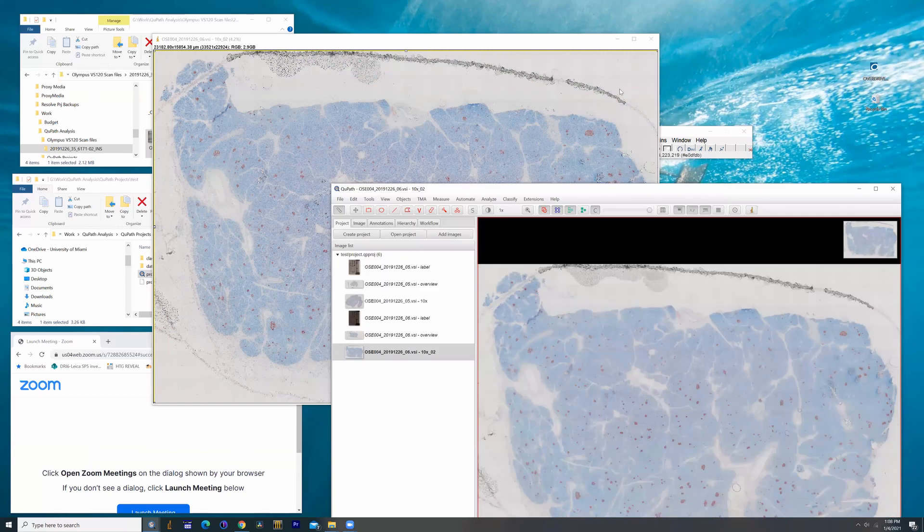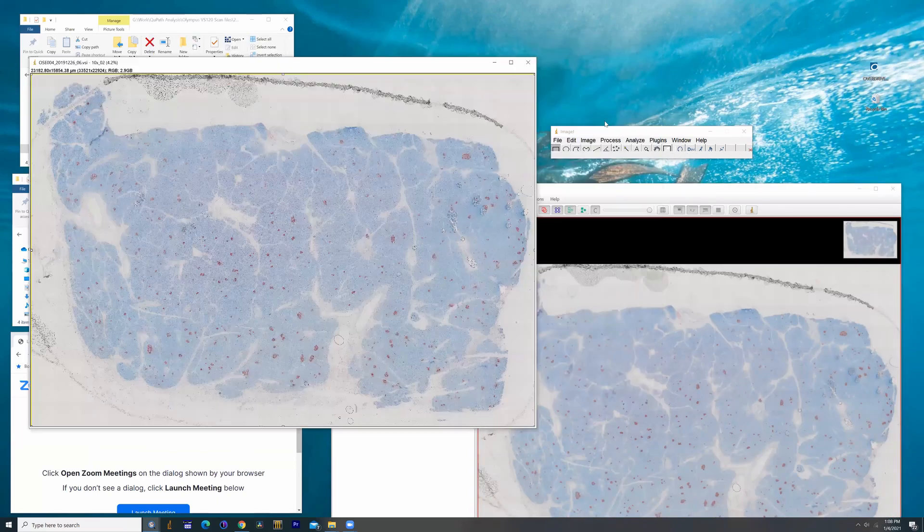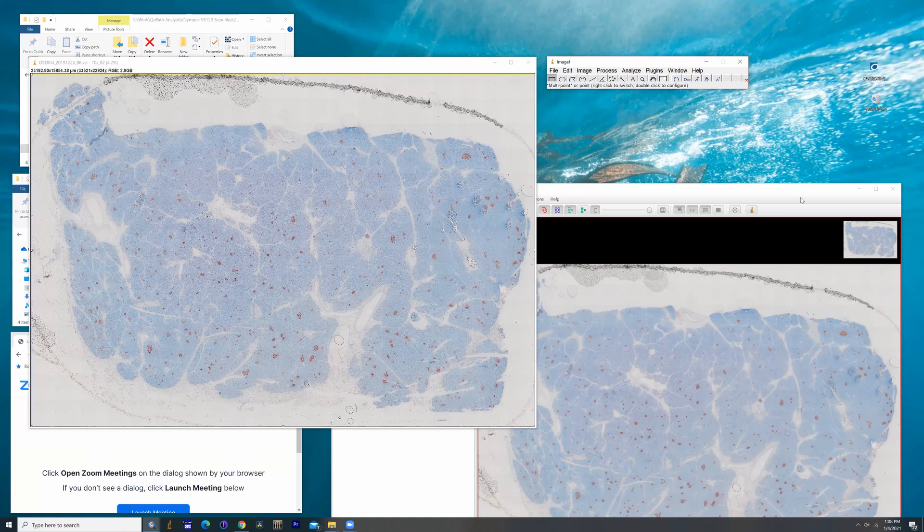What happens is you see the image opens up on top, and in the back you have the browser window for ImageJ. So for those familiar with ImageJ, next steps are pretty straightforward.